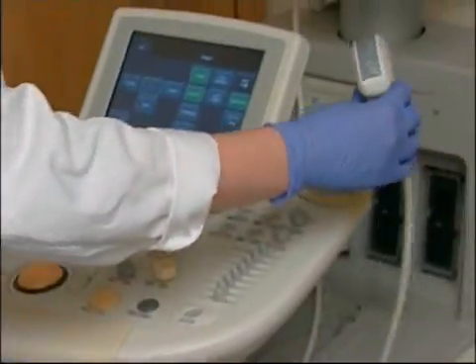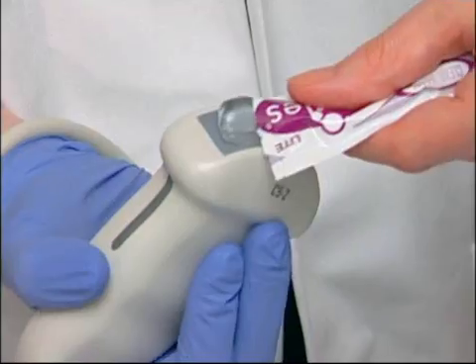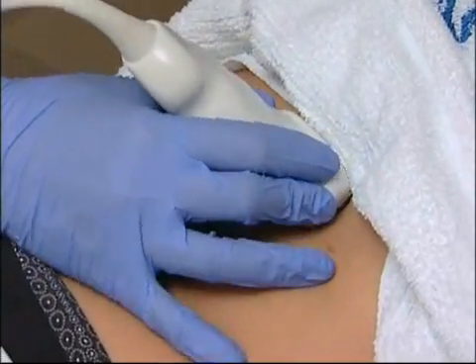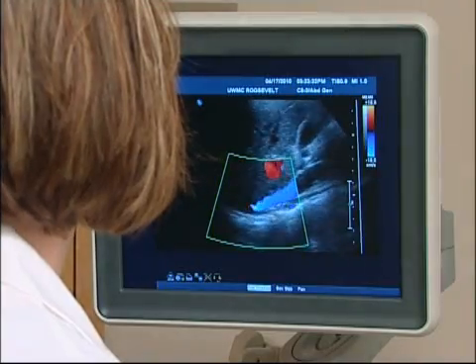I'm just going to put this warm gel on your skin, and then this camera glides on your skin. There's no pressure — if you have any pain from what I'm doing, you let me know. The sonographer applies a warm water-based gel on the skin, then places the transducer firmly on the body, moving it back and forth over the area of interest until the images are captured.